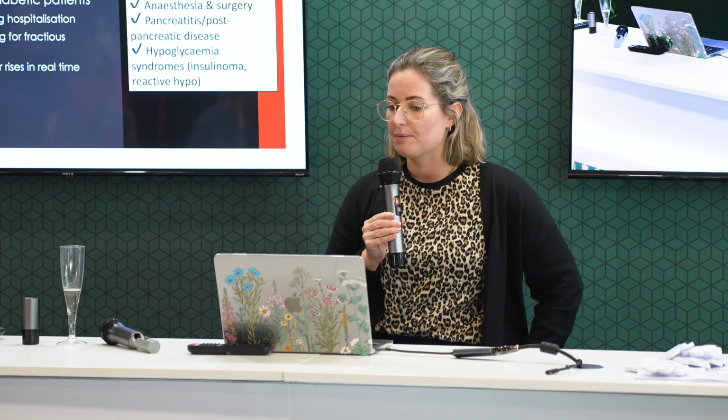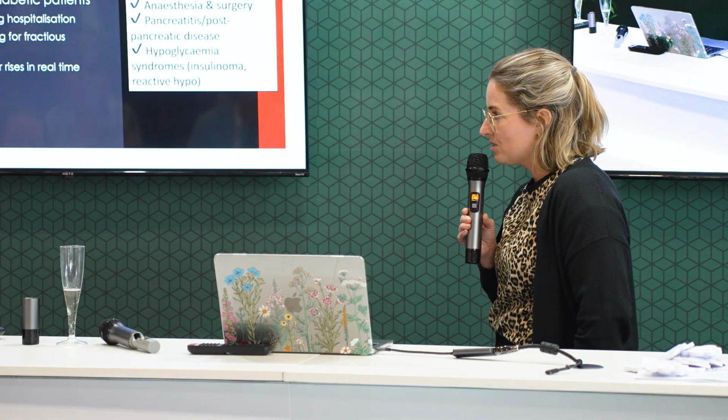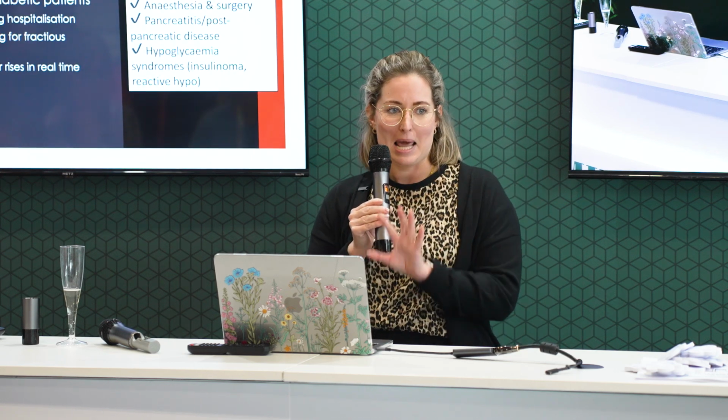Again, pancreatitis patients, or patients where we've perhaps got hypoglycemic type syndrome, so insulinoma type patients, for example, where you might be otherwise wanting to do regular blood sticking, actually the continuous glucose monitor is going to allow us, then, that's less needles for the patient.